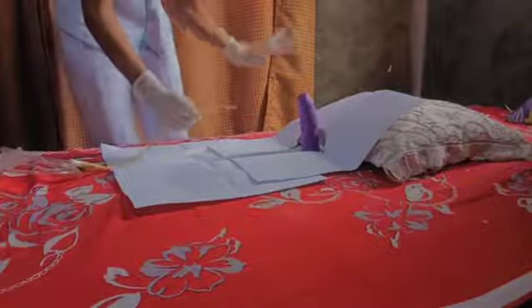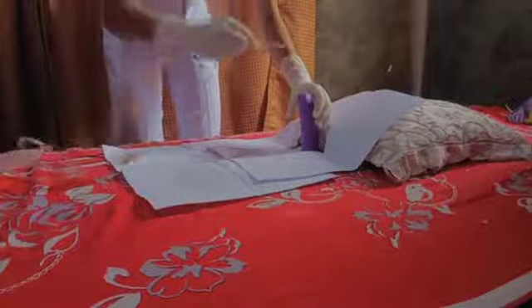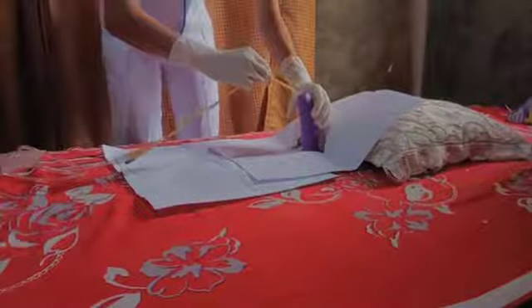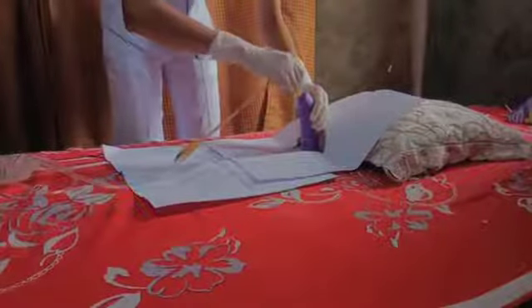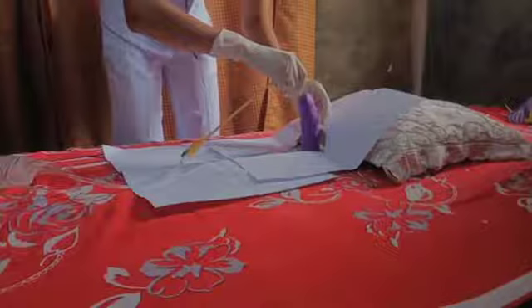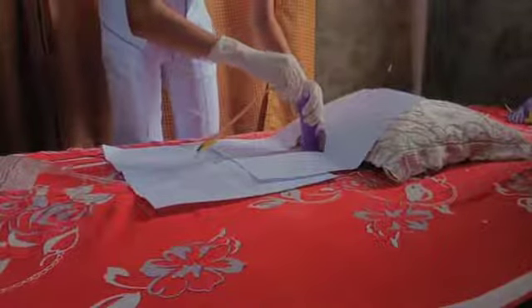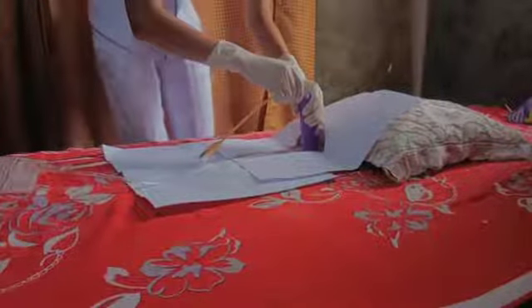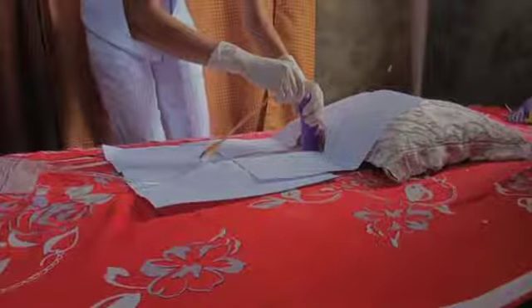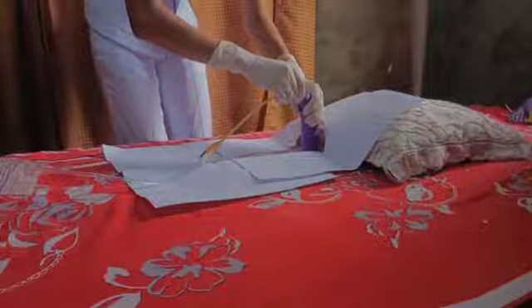During insertion, this is the time to tell our patient to inhale and exhale. 'Sir, can you please take a deep breath for me?' That is when you insert the catheter. After inserting around three to four inches, you will observe urine inflow. That is the time to further advance the catheter around one to two inches to properly anchor the balloon.